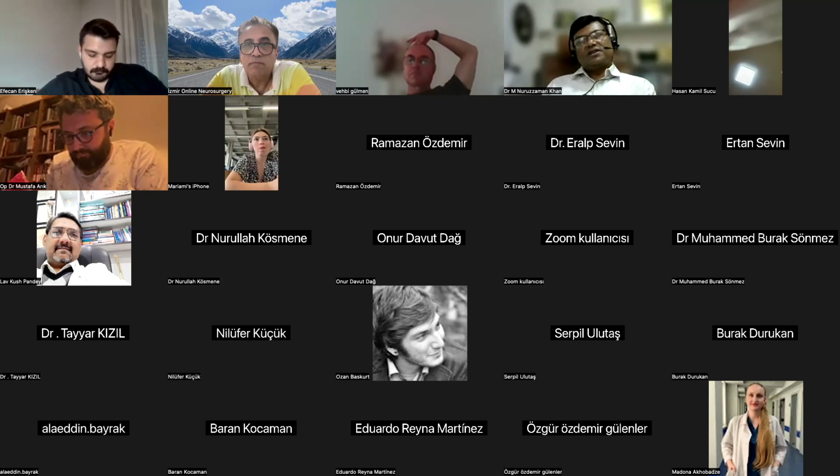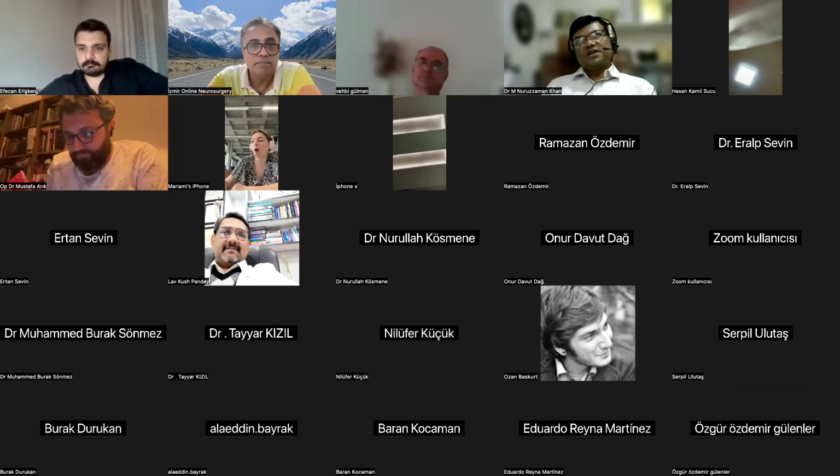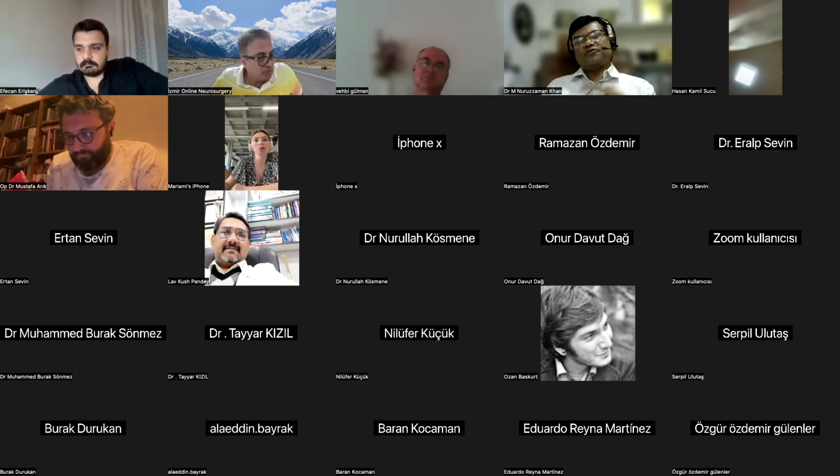Definitely, it's a challenging surgery, especially interlaminar. In transforaminal surgery, I have never seen any dural tear, but in interlaminar there is some dural tear, especially in the beginning. For beginners, there is every chance of a dural tear.